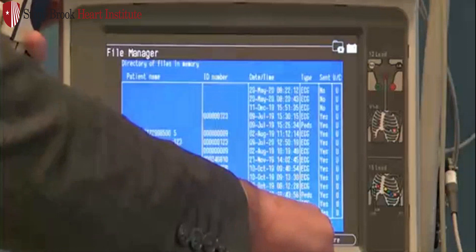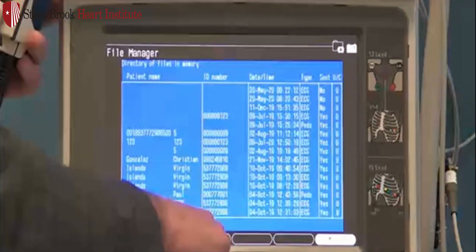To return to the main screen, hit More, F3 Main Menu.